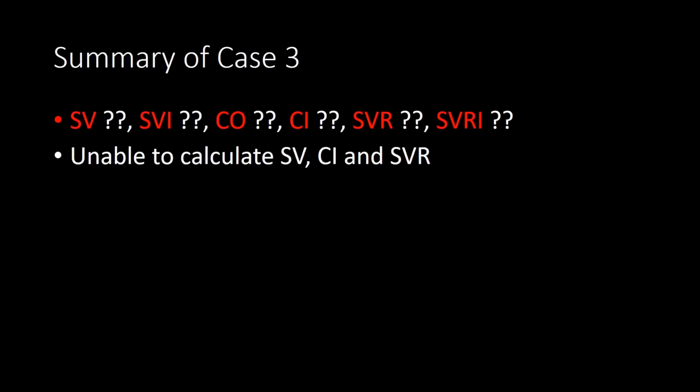And the other thing I would certainly do, which I think EM is way better about than surgery, is when you first start doing it, do it in conjunction with somebody who's done it before, and see if you're getting similar VTIs to that person, if you guys are measuring the outflow tract similarly. Also, if the patient has a Vigileo in or has a pulmonary artery catheter in, you're rotating in the CTICU, or have a liver transplant patient, you can try doing it and just kind of checking yourself against the catheter. The Vigileos themselves are not necessarily so accurate, but just check yourself in some format until you become used to doing it and feel confident in your own measurements.